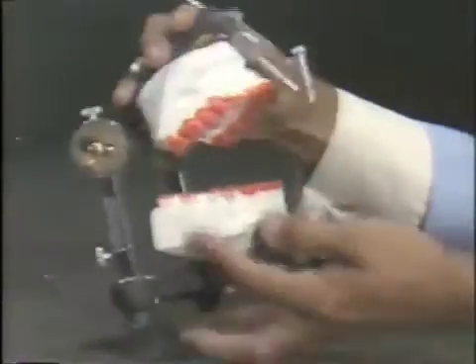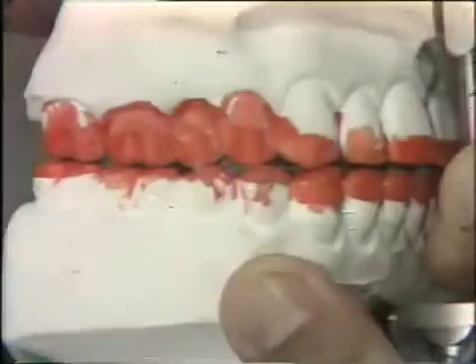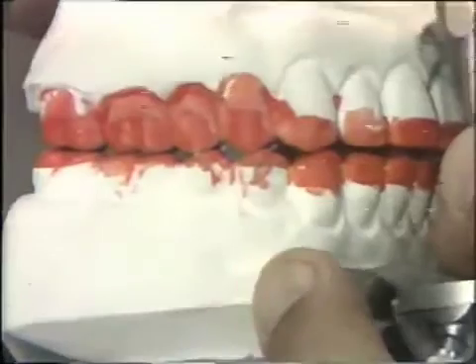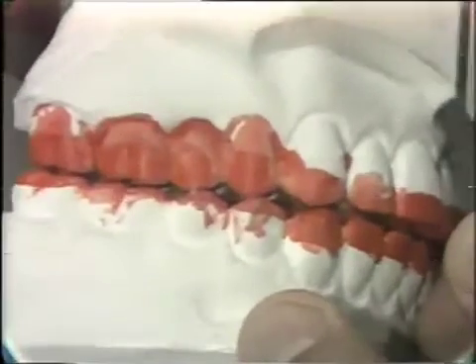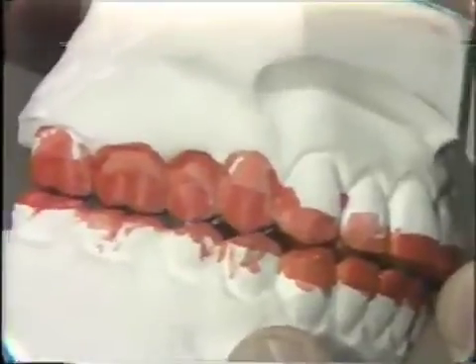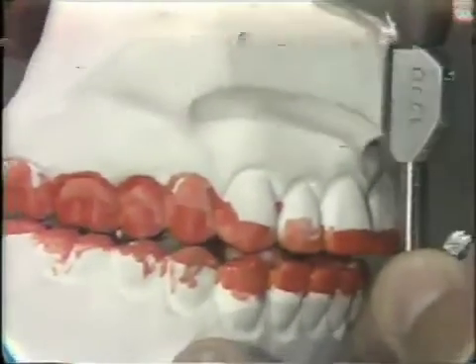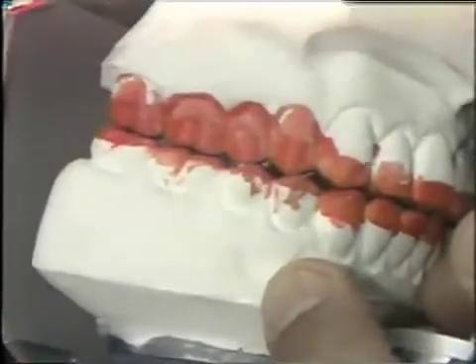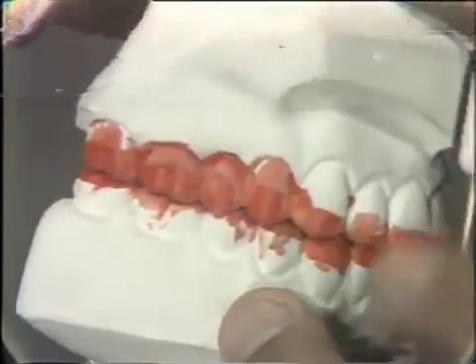If we close the articulator together and look at it again from the side and go into the excursions, you'll notice now that there is a contact between the buccal cusp on the right-hand side on the cuspid, first bi, second bi, and on a little bit of the first molar. This is a perfectly acceptable relationship in the working excursion — a smooth area right out here. We're adjusted out cuspid tip to tip. If I go beyond the cuspid tip to tip, I'm contacting on the other side. So we're only adjusting out cuspid tip to tip, as there is no point in going beyond that.